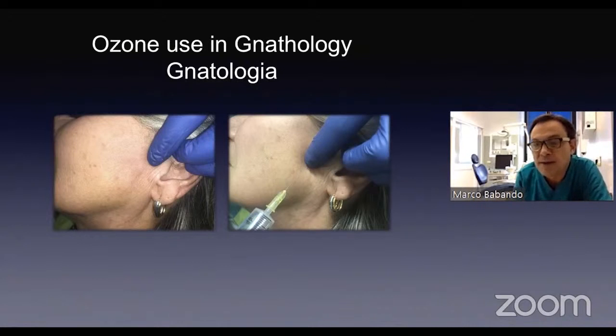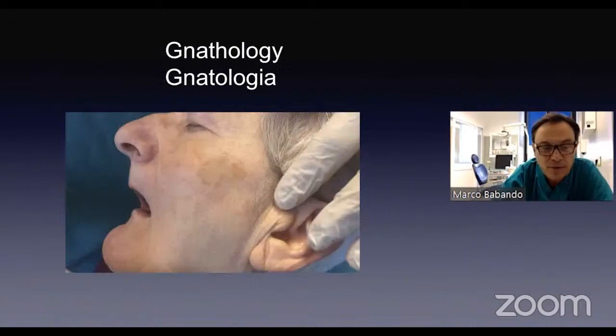And in these cases, we can avoid muscle contraction and hypoxia that can form in the temporomandibular area with subcutaneous injection. Owing to ozone, we can have a myorelaxing and anti-hypoxic effect. Patients already from the second application ask for the ozone therapy because they are used to living with muscle contractions and they find it helpful.